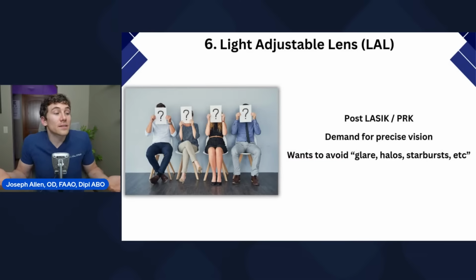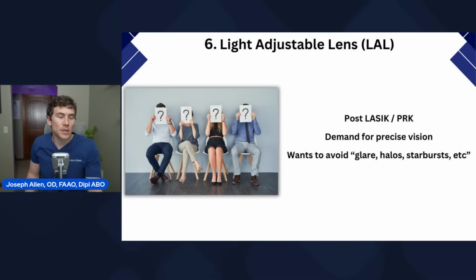So whom is this really for? Who is going to be the best candidate for the light adjustable lens? Somewhat based on my personal experience, anybody who's been post LASIK or had LASIK before, maybe in the mid 1990s, late 2000s, anybody who's had LASIK or PRK or other forms of refractive surgery, this may be the best option.